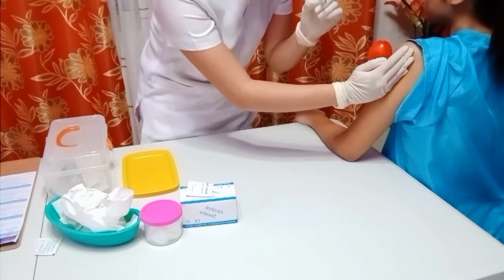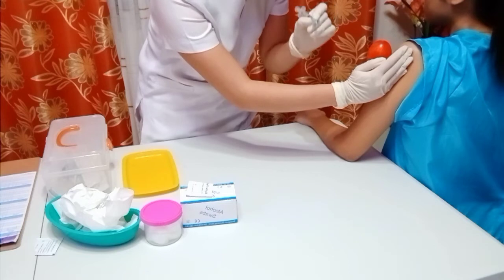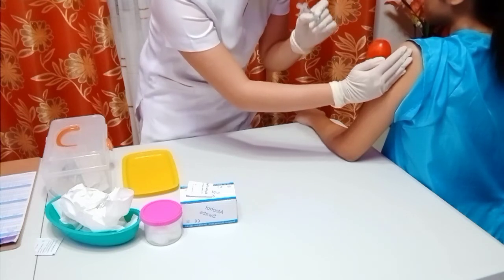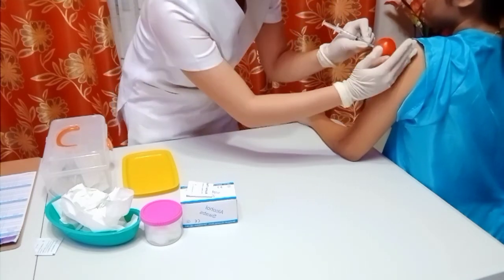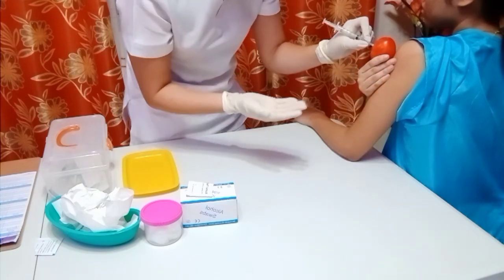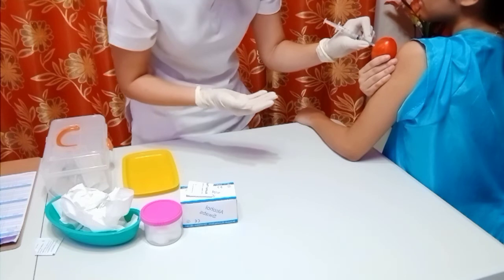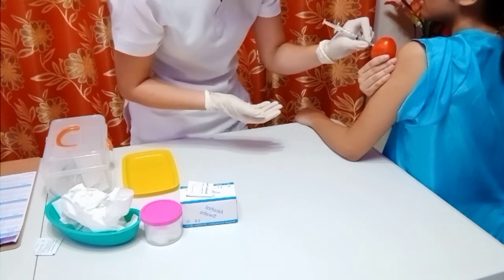But since I will not be able to inject the medication directly into the client's arm without the supervision of a registered nurse, I will instead use a tomato. So, next is to release the skin. Releasing the skin when the needle is inserted is done to avoid injecting into compressed tissue.